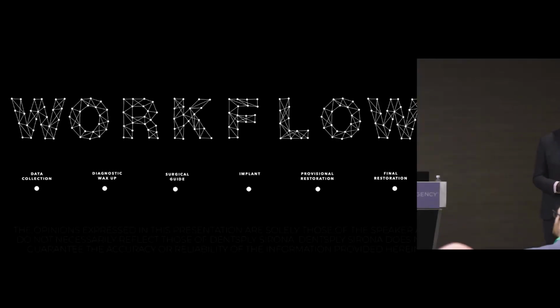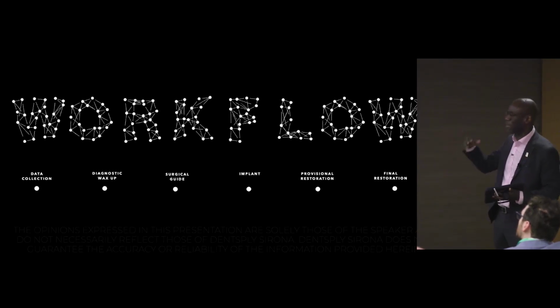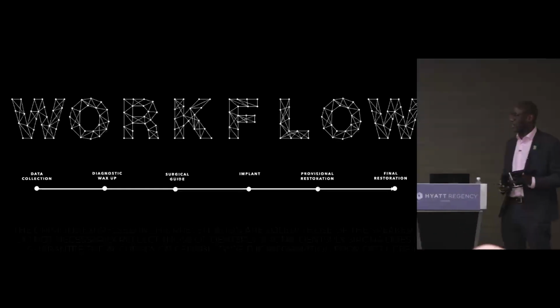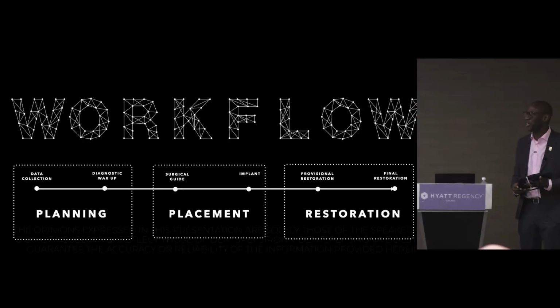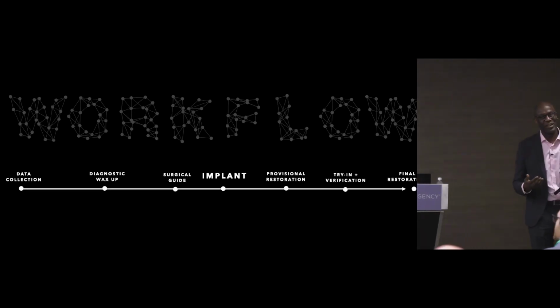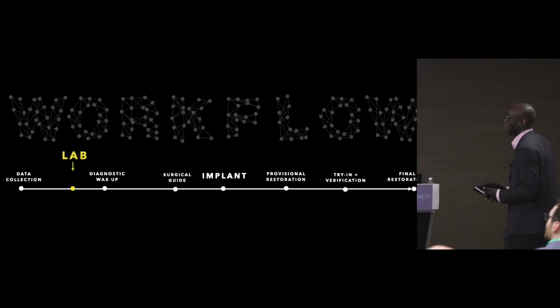Now, we're all aware, and this is not new, of what we do with digital workflows. We collect data, we get a diagnostic wax up, from there we make a surgical guide, place the implant, make a provisional and a final. But you see Steve standing over there, and the reason why he's over there is, as much as I like to say, look, it's planning, placement and restoration, we're all aware about the role that labs play. And actually for me today, being here amongst all these technicians, I feel like a slight alien, and I feel like I'm cheating as I wander around the corridors.